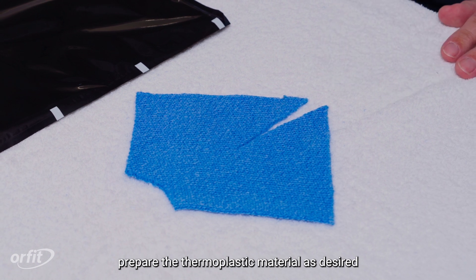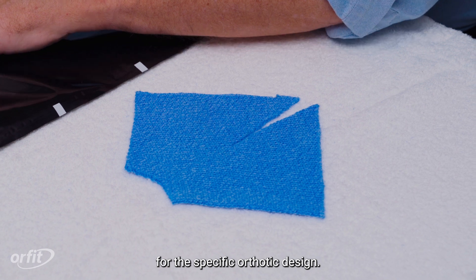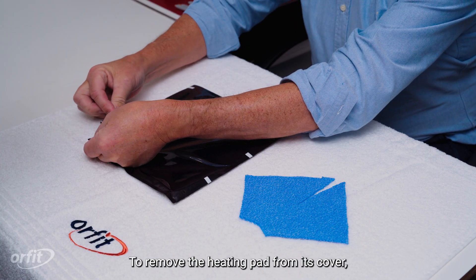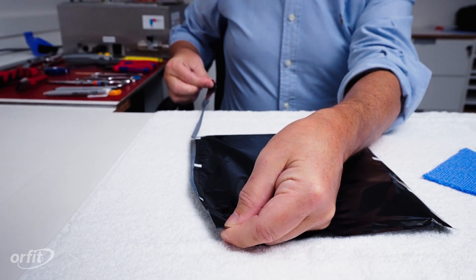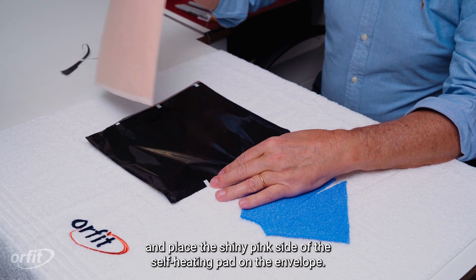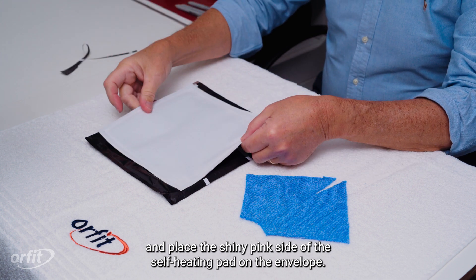Before opening the heating pad, prepare the thermoplastic material as desired for the specific orthotic design. To remove the heating pad from its cover, tear the notch carefully to open the package. Remove the self-heating pad and place the shiny pink side of the self-heating pad on the envelope.